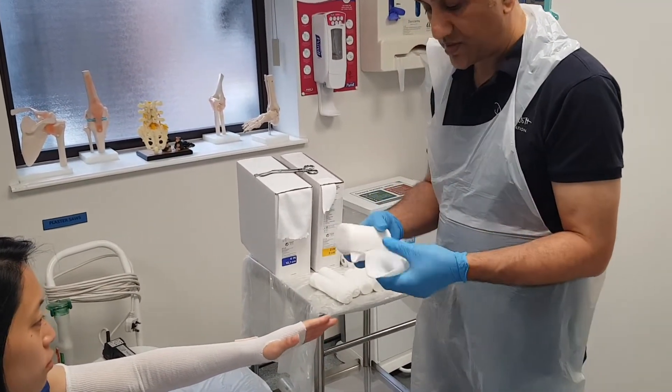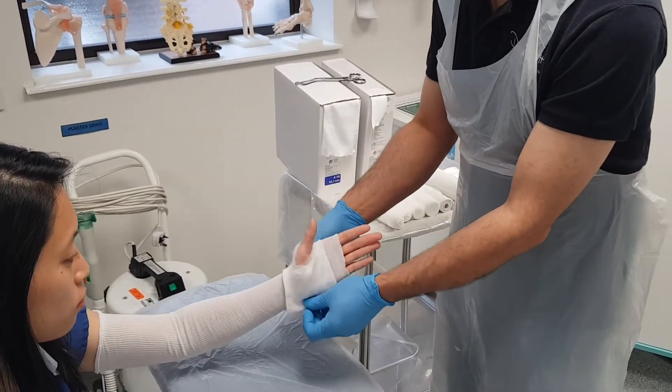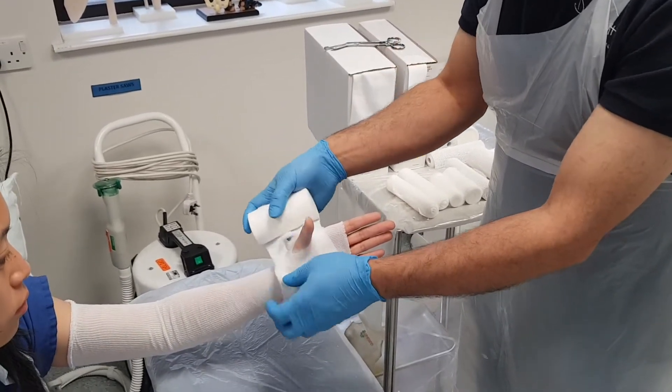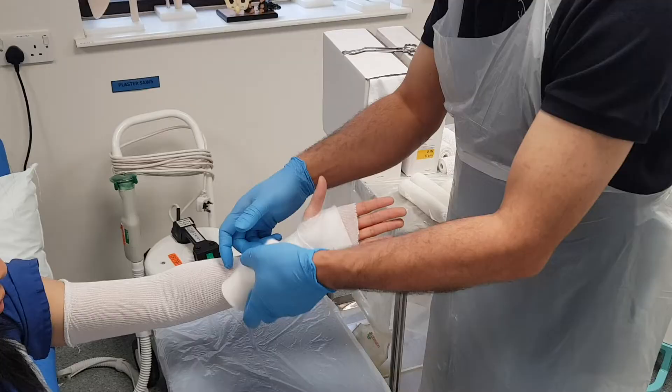Over the top of that I'm going to apply the wool. I'm going to make a hole in the wool to secure it around the thumb. I want to have two layers at every level, so I'm going to overlap by 50% every time I go around the arm.